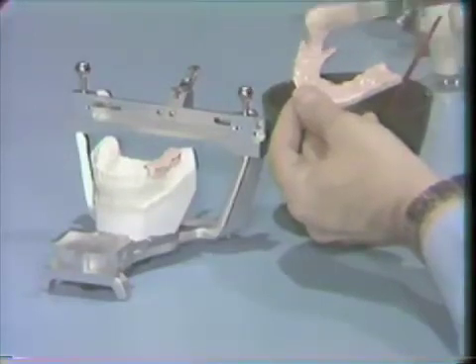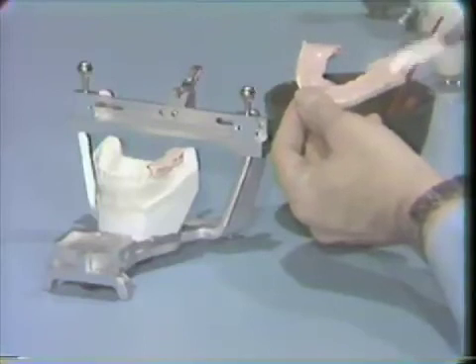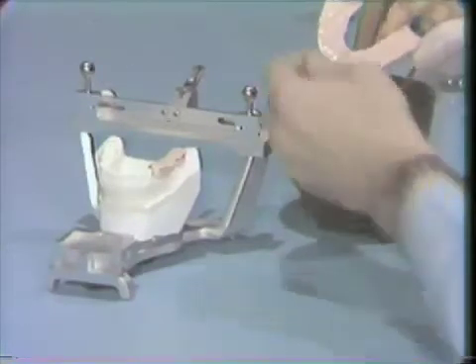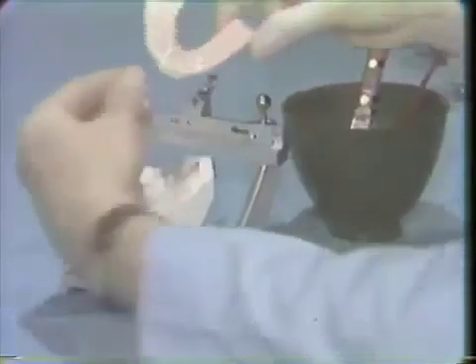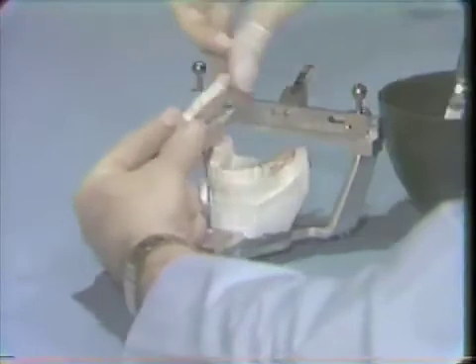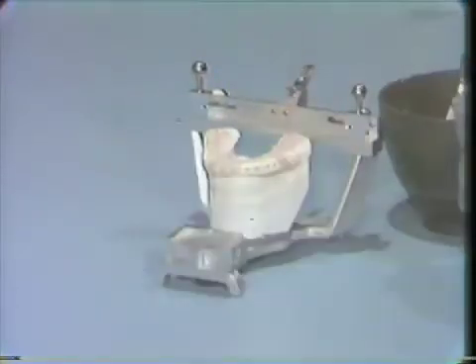then our objective is to just register the occlusal surfaces of the rest of the dentition and pick up our functionally generated wax registration in stone on the opposite side. We will have to wait just another moment while this attains a proper consistency. Take it into the patient's mouth, and again, this is just a little more soupy than we would actually like to have it, and place it on top of the teeth like so. Gently place it and allow this to harden.